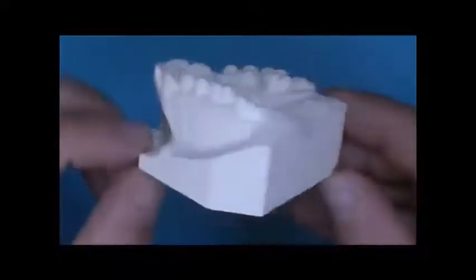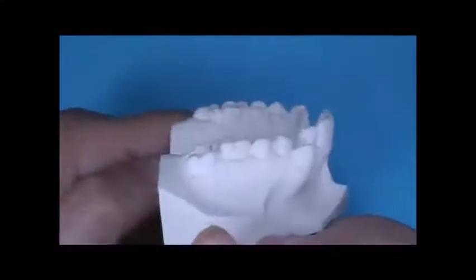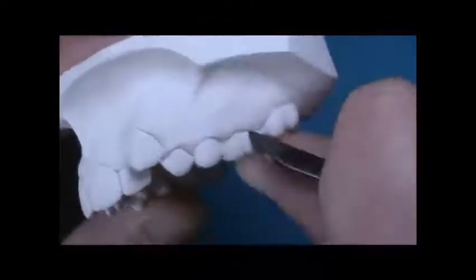Survey model for distortion. The clinical crowns of the posterior dentition as well as the palatal area must be accurate. Prepare a model by filling holes with stone and defining anatomy with lab knife.